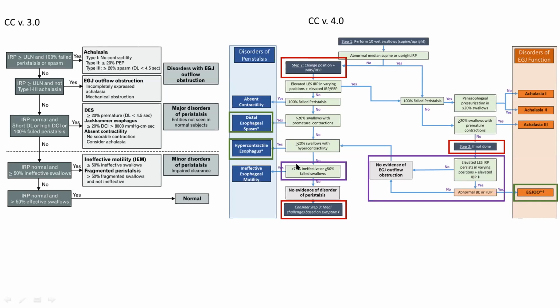Dr. Pandolfino has spent much of his career investigating the pipes and valves of the esophagus, as he says, and he joins us today to discuss findings from his recent publication in the Neurogastroenterology and Motility Journal on the latest iteration of the Chicago classification for esophageal motility disorders based on high-resolution manometry.